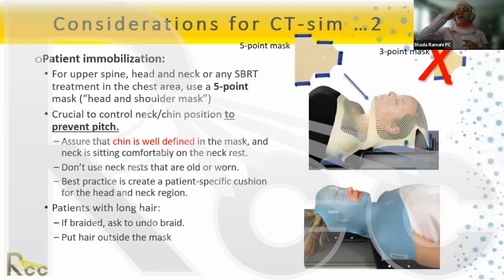The shape of the mask. And then there is a bite built into the mask. Okay? And then, of course, you do a better definition of the neck and the chin. But this is kind of a built-in bite from the mask itself. And this was his suggestion. This actually was last week, and we haven't implemented it yet, but it makes sense.